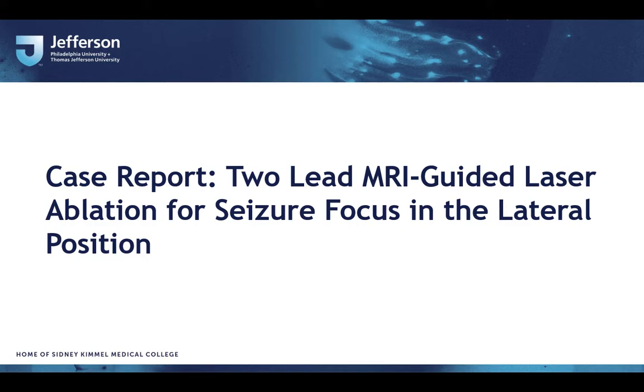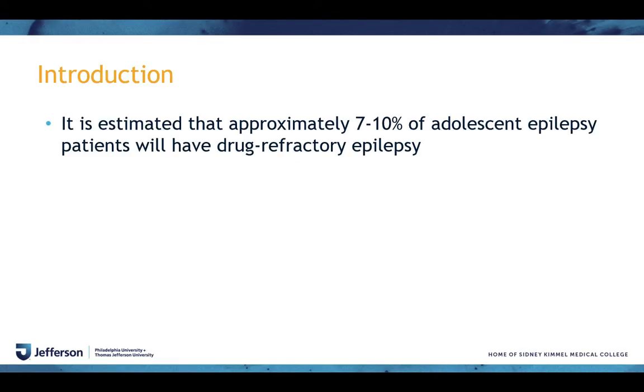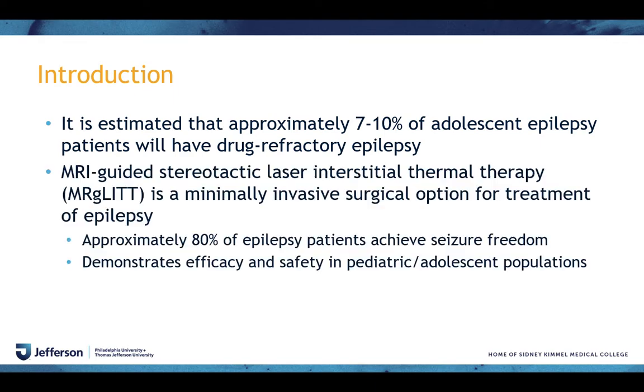This is a case report of a 2-lead MRI-guided laser ablation for a seizure focus done in the lateral position. As an introduction, approximately 7 to 10% of adolescent epilepsy patients will have drug-refractory epilepsy. For this population, MRI-guided stereotactic laser interstitial thermal therapy, or MRG-LITT, is a minimally invasive option.